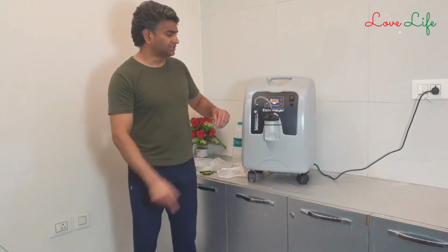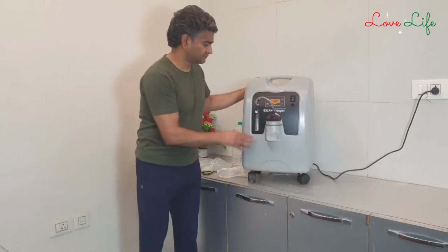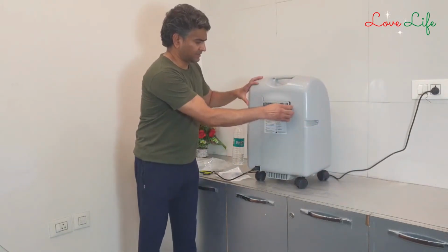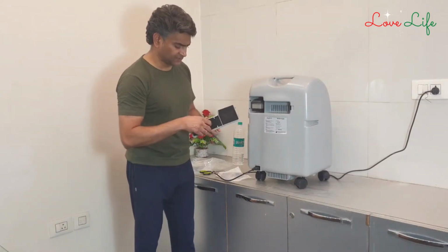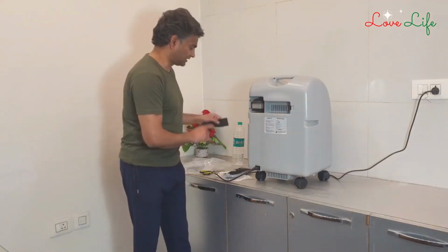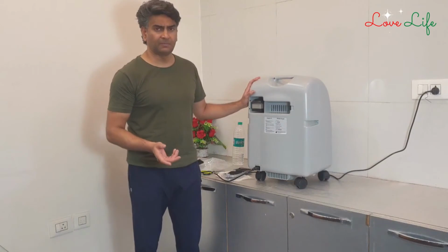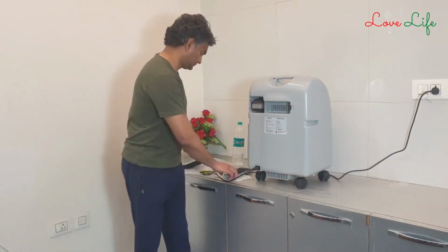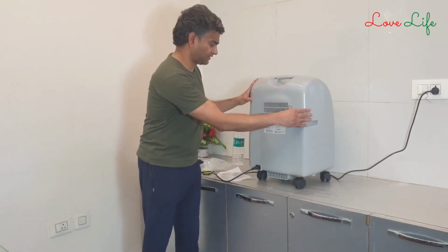So let me shut down the machine first and show you what's on the back. So we open the rear side. You see there is a filter, there is another filter. This filter is changeable. You need to change this. So there is an extra. There is another filter which needs to be replaced maybe after 25,000 hours. And it's easily available. Let me refix it.